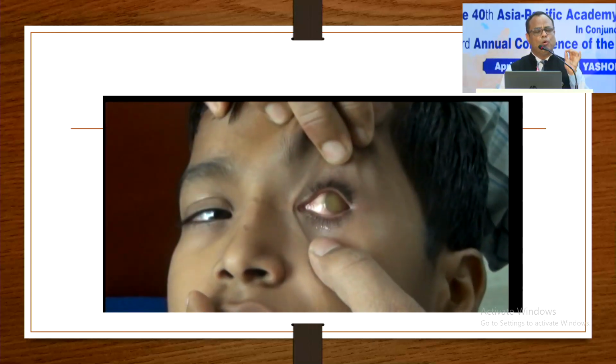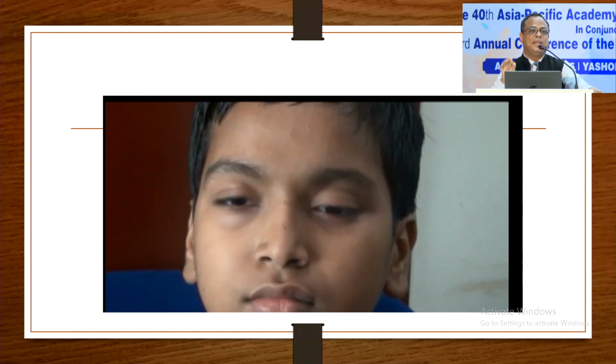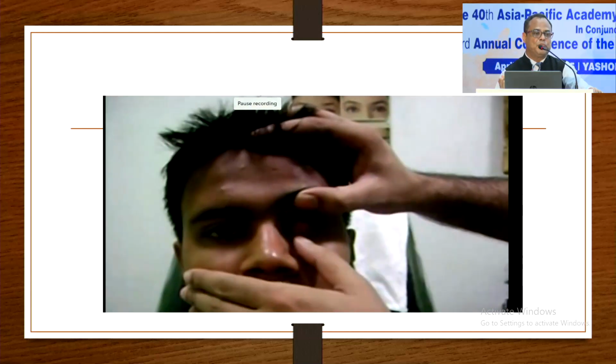Here, one biggest advantage is that the cornea remains the same except for the epithelium and endothelium. Out of these 15-16 cases, one of my patients developed a corneal ulcer, and we could treat that patient from a corneal point of view. So we can explain there may be issues on the cornea, but there will be no extrusion, nothing. Even a low-cost ball like acrylic, which is easily available, we can implant, and motility is excellent.